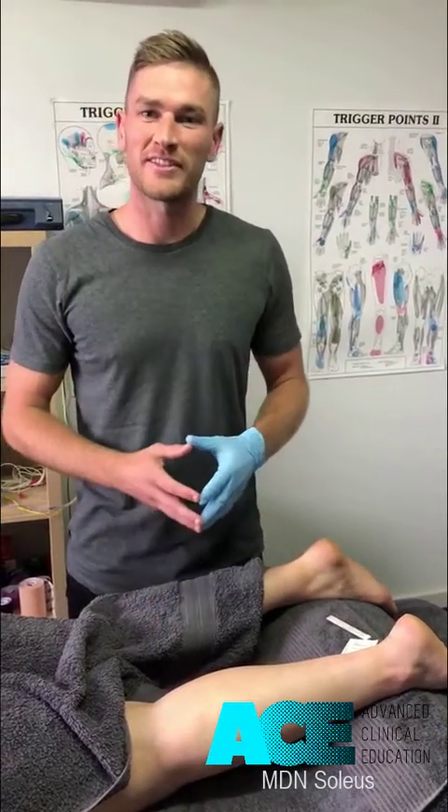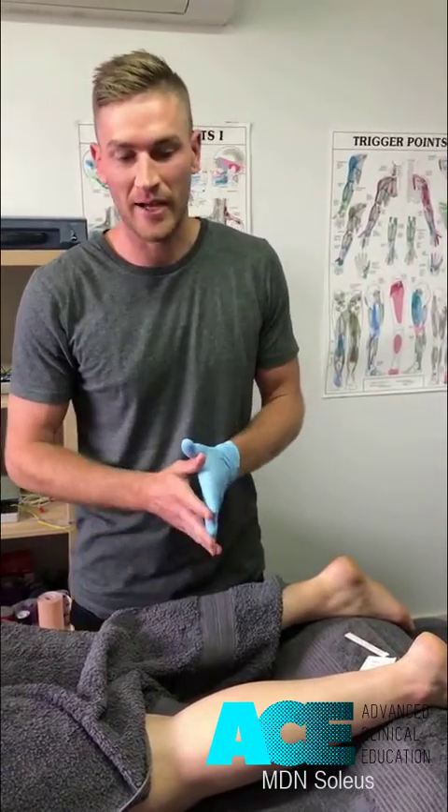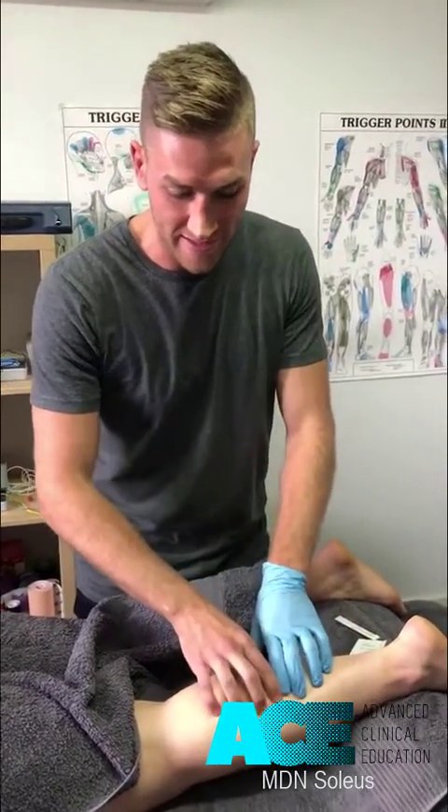We're going to look at dry needling for the soleus muscle. This is such a powerful plantar flexor and it often gets riddled with trigger points, so we're going to look at some dry needling techniques to address this muscle safely.